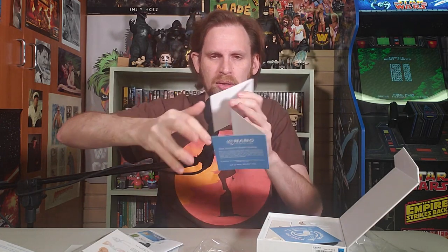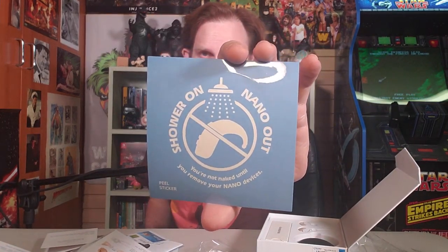Your journey to better hearing — there's a lot of info here. There's a sticker that says 'shower on, nano out' — don't shower with these things in, don't do it. It says you're not naked until you remove your Nano devices. I love it — they've got a sense of humor. That's great, super fun, and a helpful sticker.